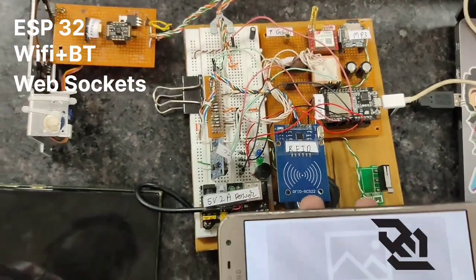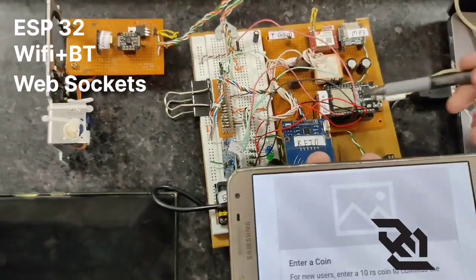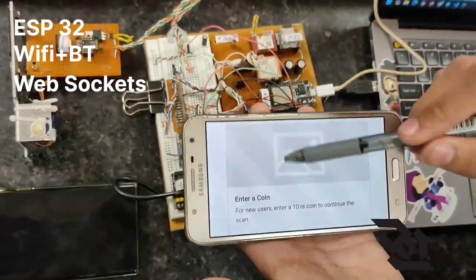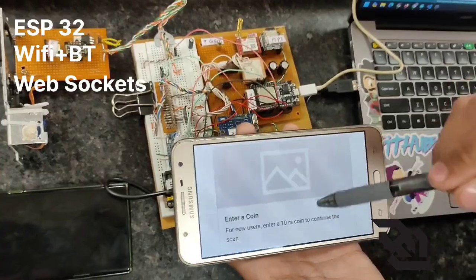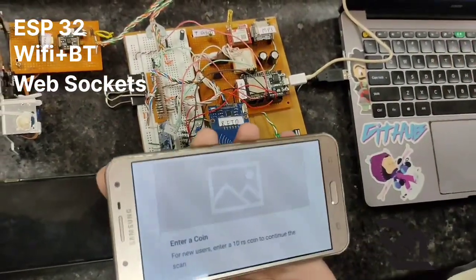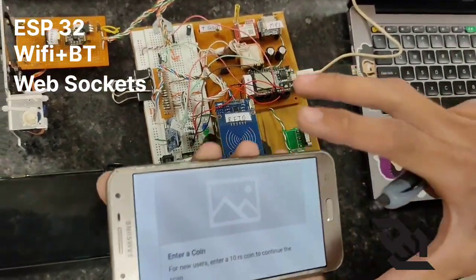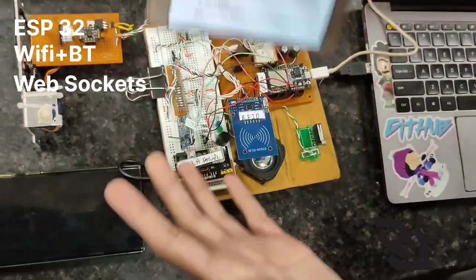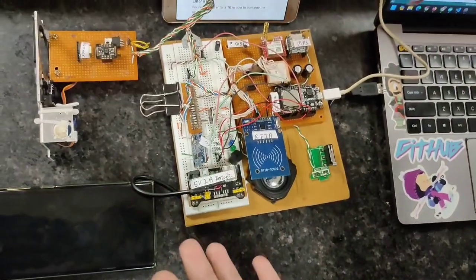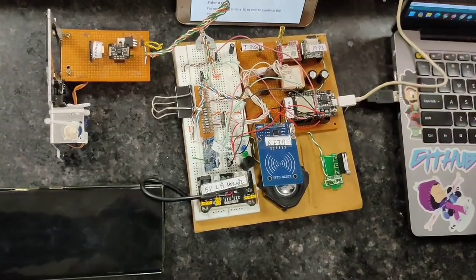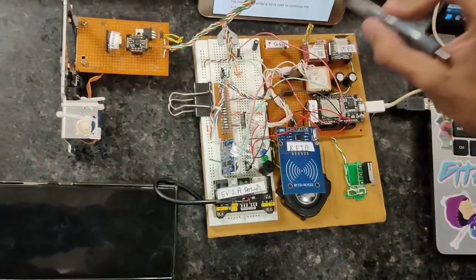If a new user was found, dynamically a modal would appear here for his username and things. Consider it as a display. A new user came, entered his data from the display.